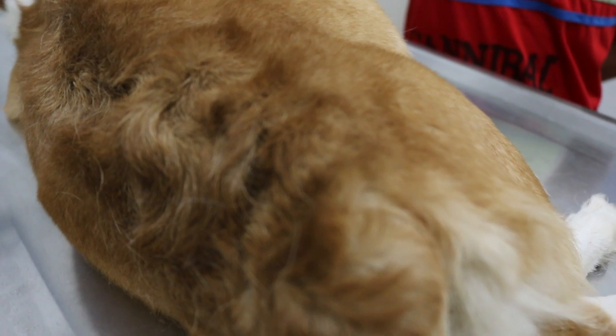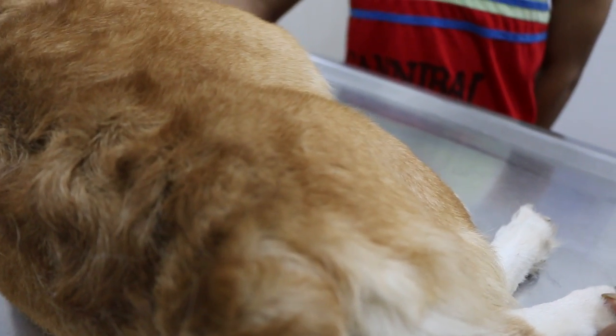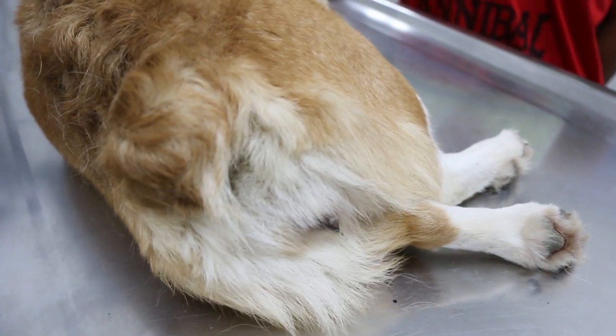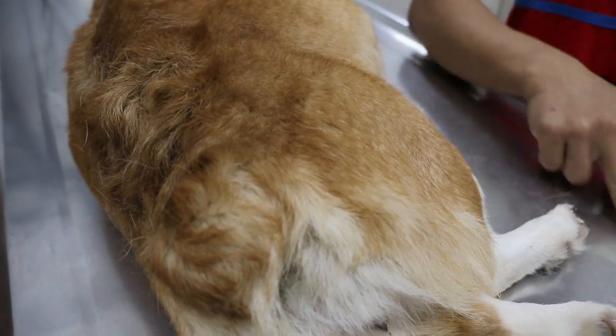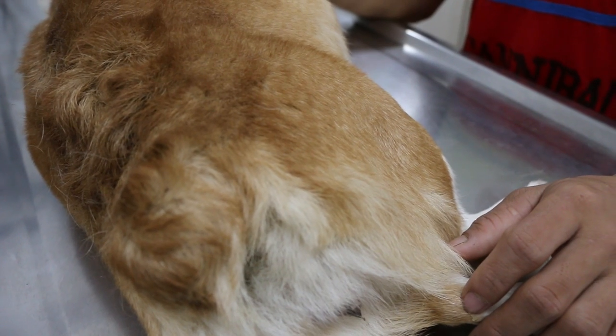And then it should be monitored for temperature. Let's say every 6 hours. So at 10 o'clock you check, and then at 4 o'clock you check, and then you let me know the temperature drop. This thermometer is electronic, not the shaking one. So now we know 39.6. You just get the thermometer to measure. That's why I say you take it every 5 or 6 hours.